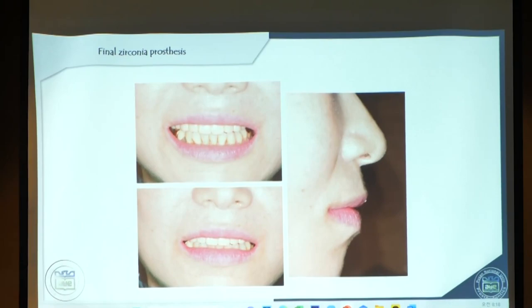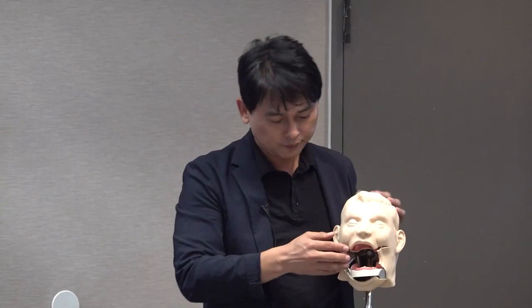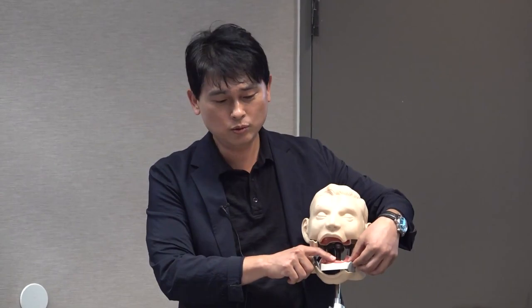To finish it, there is no preparation of the intraoral scanner. So let's imagine we scanned the upper and lower jaws. Before scanning, I attached the resin reference in here.